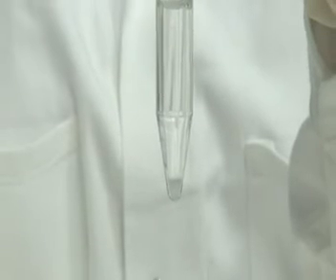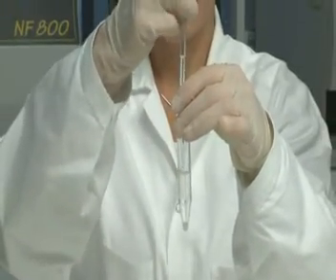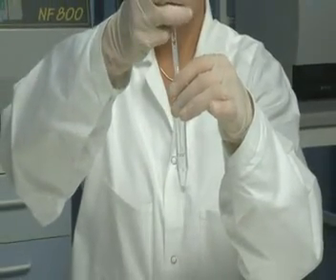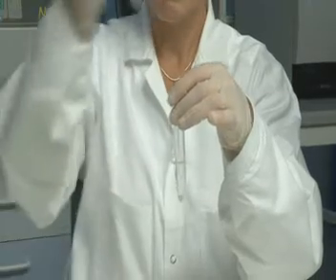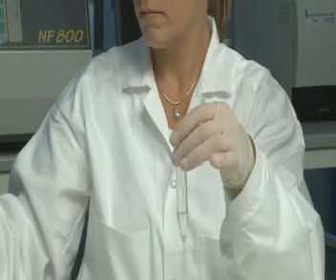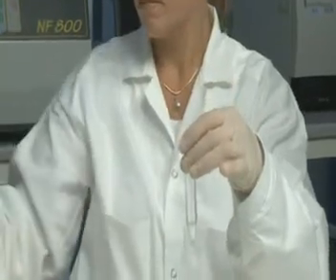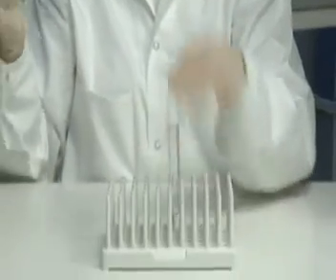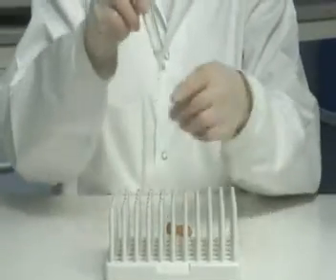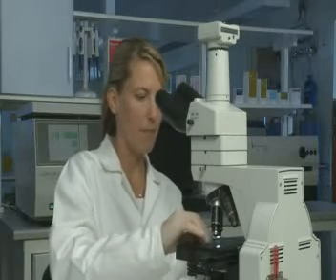After centrifugation, aspirate the PureSperm Wash leaving 1 milliliter. Re-suspend the sperm pellet. The sample is now ready to use.